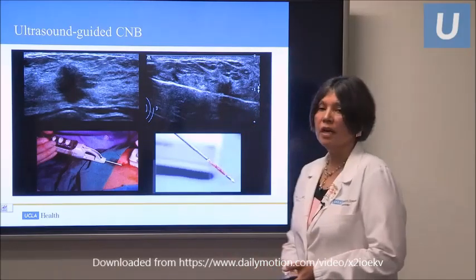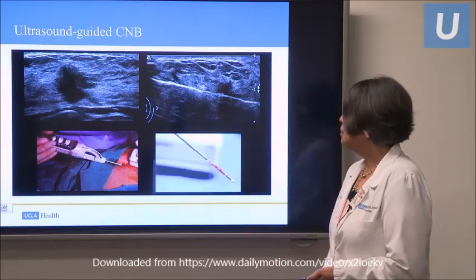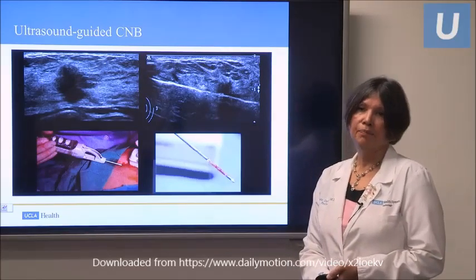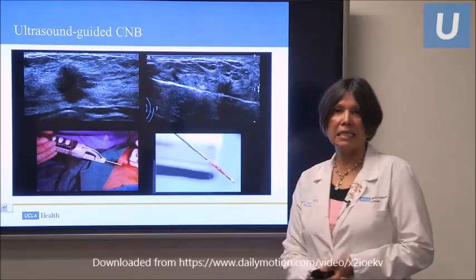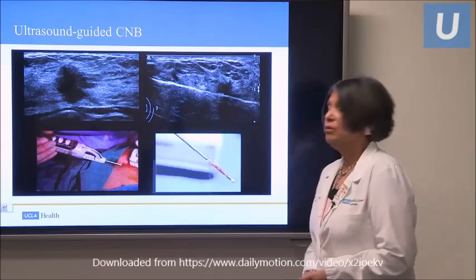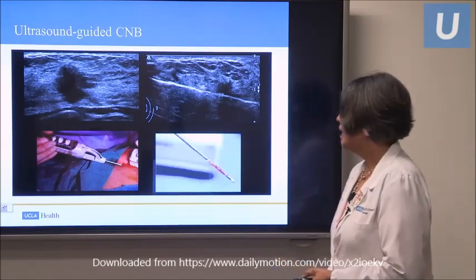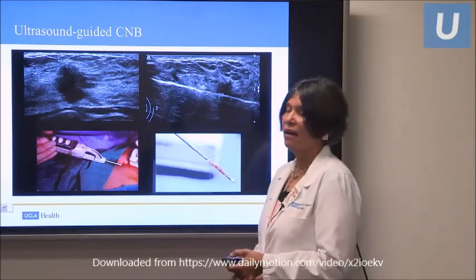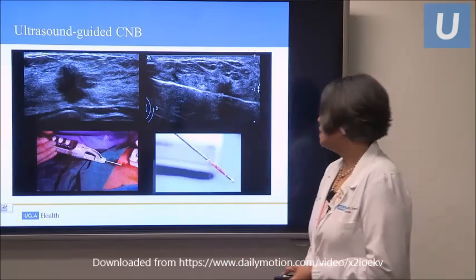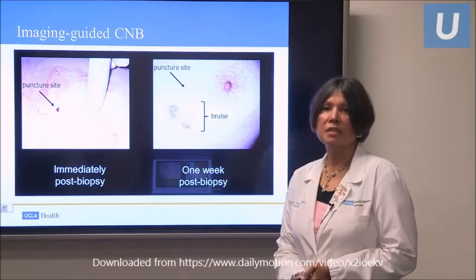We basically core it. You're taking a ball of tissue, and we're just punching holes through it. We do not remove the abnormality. So if it comes back as atypical or cancerous or precancerous, that would require surgical intervention. Now, because not all masses look like that, and we have many benign masses, this method has been helpful in avoiding surgical biopsies.